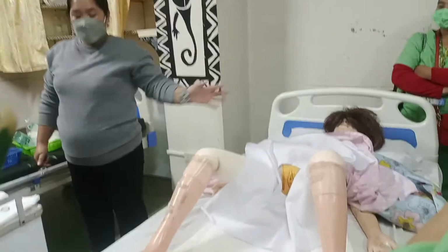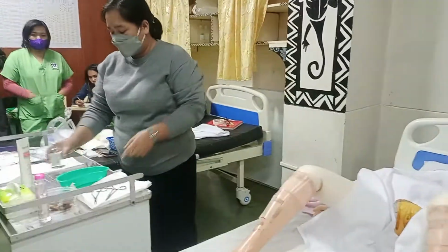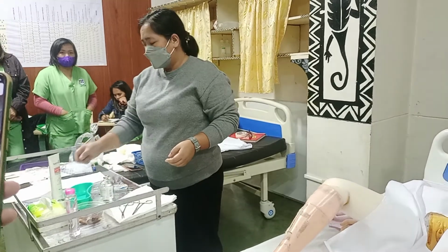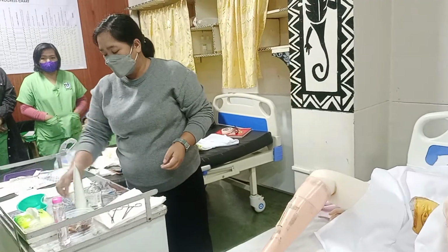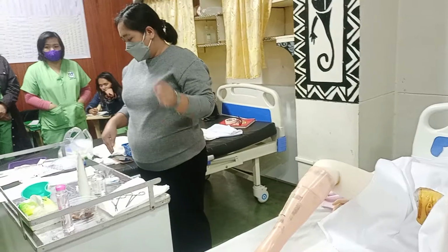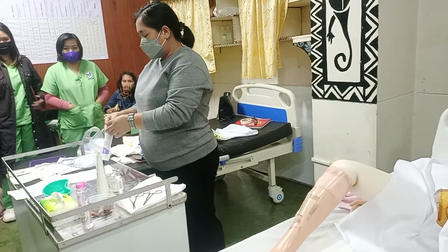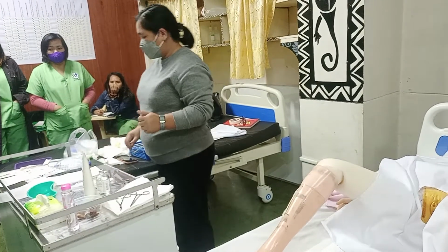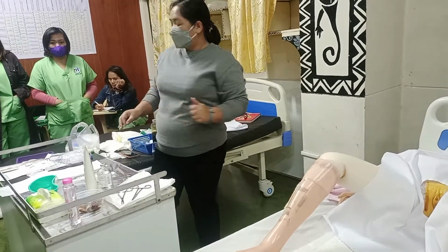After that, nalagay ko na, I will prepare my equipments. Okay? So, ada tiyag serve. Sino tiyag serve? Sino ti circulating nurse ko? Pag magbubukas ka, ma'am, pag magsiserve ka, just open it and do not touch anything inside. Okay? Okay, so there. I will now start with my sterile procedure.